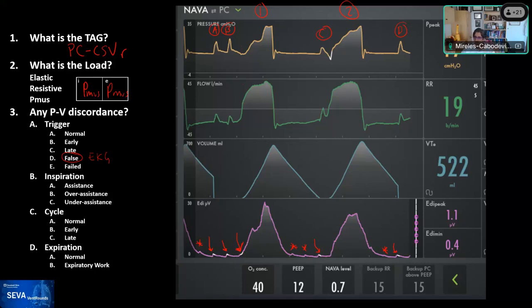Yeah, Fernando, well, perhaps not misplaced, but we adjusted it. But yes, you need to take a look at the catheter and adjust it to see if you can get rid of those because they're creating noise on your signal. So that's a false trigger in NAVA, perhaps of no consequence, but present, and it can generate enough anxiety in us when we're taking care of these patients.